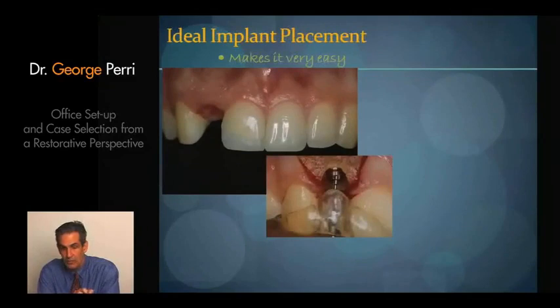And the key here is the position of the head of the implant. So many times we think it doesn't really matter, or to be safe, let's sink the implant further. It's an immediate extraction site. We've laid a flap. We know we're going to lose some of that labial bone.